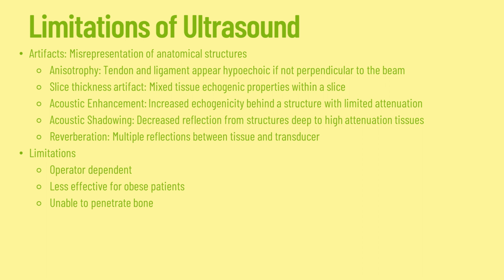So we always want to, again, know the foundational anatomy, because another limitation with ultrasound is the actual ultrasound user. So as physical therapists, again, we need that foundational knowledge of anatomy, but it is important to palpate, to know what you're trying to view in the ultrasound image and know where to go anatomically so that you're getting a better image and you can know whether or not you're having those artifacts presenting themselves or if it is actually an injury or a limitation within those soft tissues.